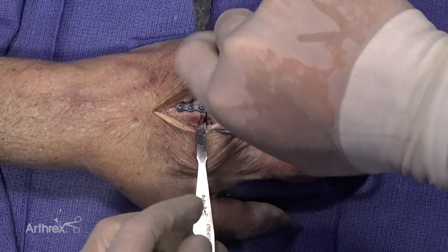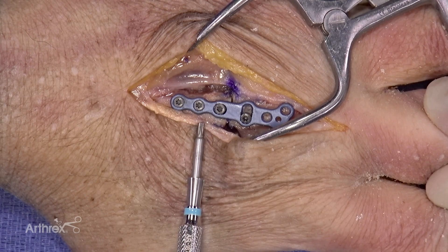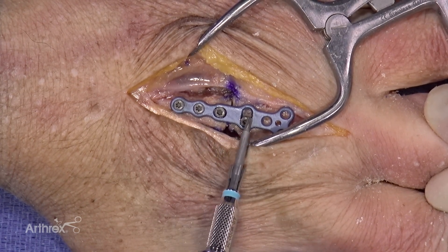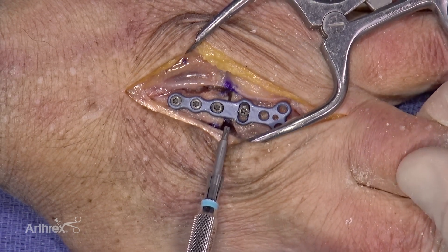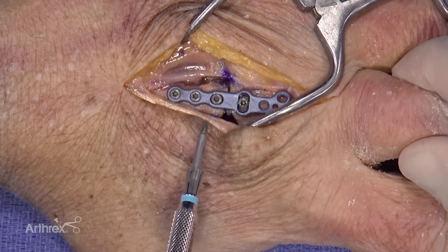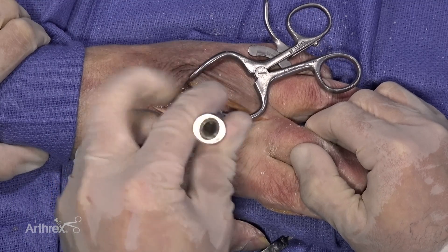This screw is placed to secure the distal portion of the osteotomy. The screws proximal are now tightened in a bicortical manner. Once proximal fixation is obtained via the bicortical screws in the straight portion of the plate, the off-center screw in the oblong hole is then placed back into its position in a near bicortical manner. You want to leave some gap between this screw and the plate to allow for rotational correction. The surgeon is then able to dial in the rotational correction by rotating the finger in the distal segment in that oblong hole from maximal radial position to maximal ulnar position. Once the appropriate clinical rotation of the digit is obtained, the screw is then taken down and secured in a bicortical manner to the plate, maintaining that rotational correction.